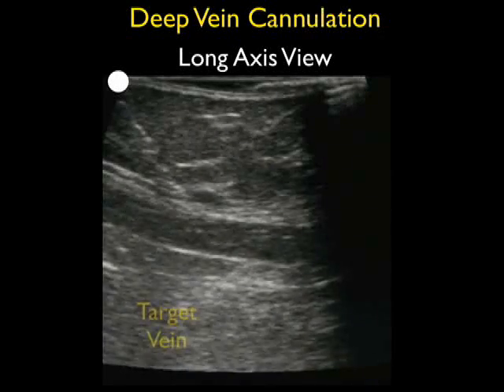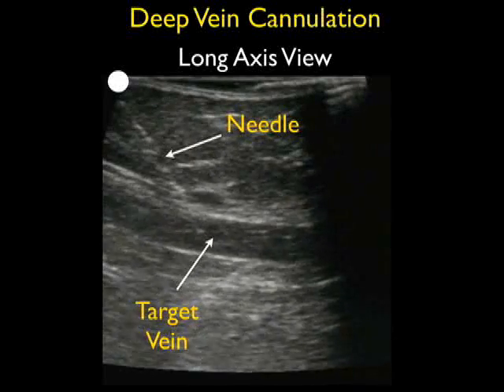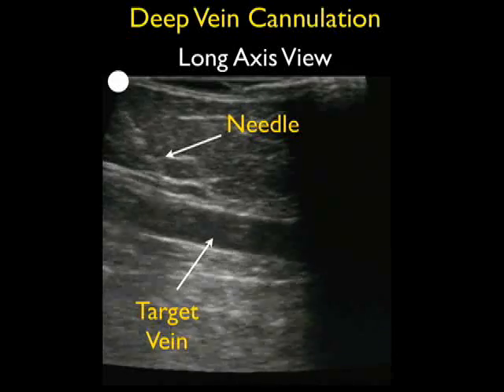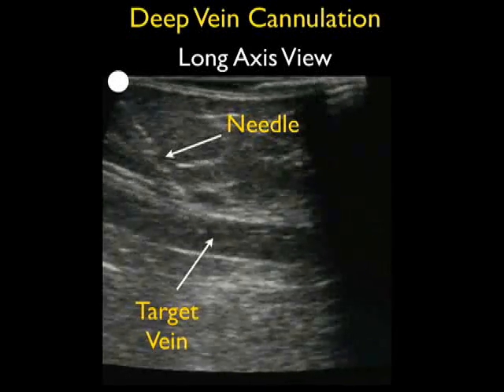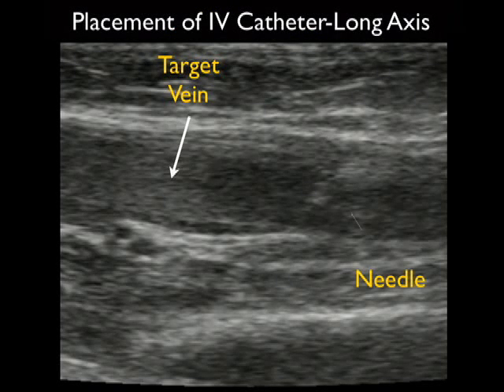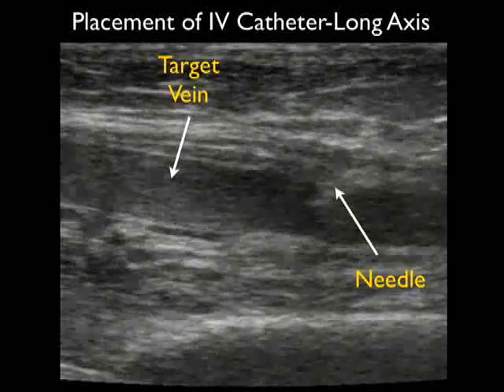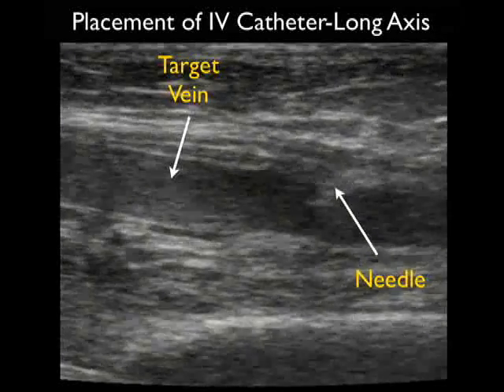Now let's take a look at a deep vein cannulation using the long axis orientation. Here we see the needle coming in from the left to the right. Notice the echogenic needle coming down to the target vessel seen about midway down on the ultrasound image, and notice the tip of the needle seen within the lumen of the target vein. At that point we've assured that the needle tip is within the lumen at the correct depth, and we can go ahead and thread the catheter. Here's another video showing a cannulation attempt in a long axis orientation — notice the needle coming in from the right, and we see the tip of the needle securely within the vessel lumen. Notice then we're going to pass the plastic catheter.